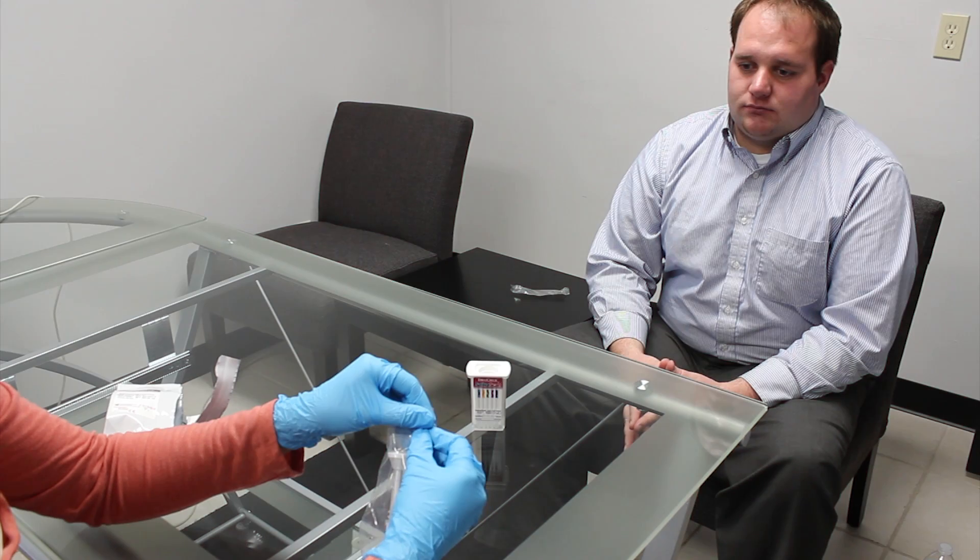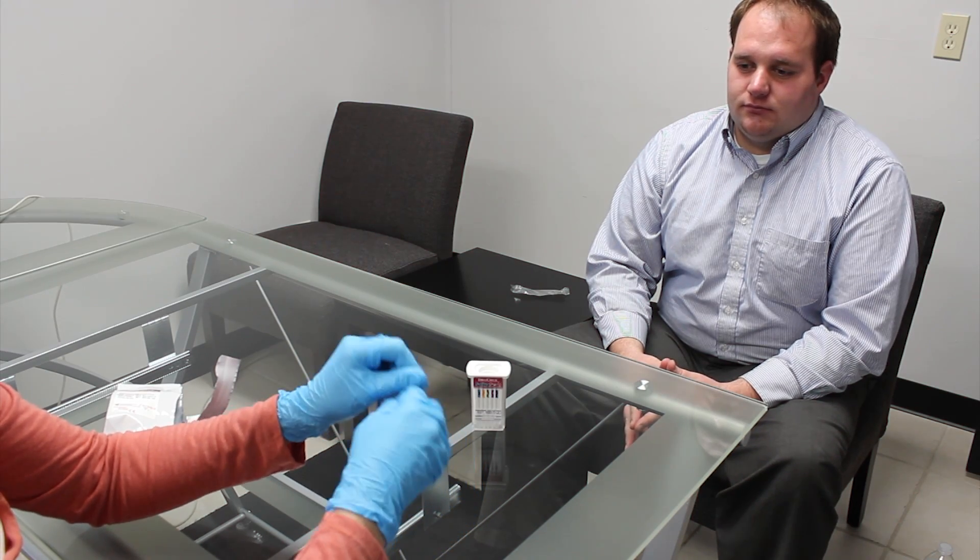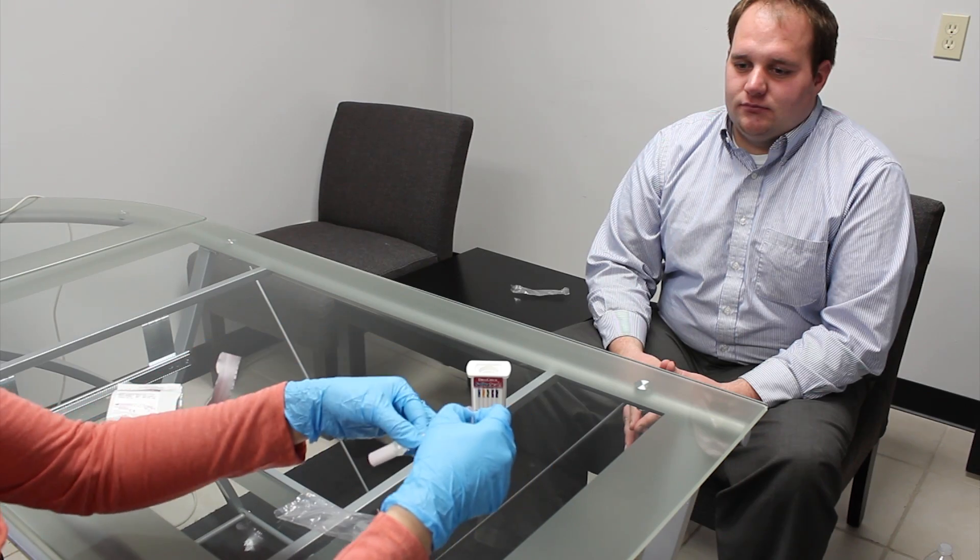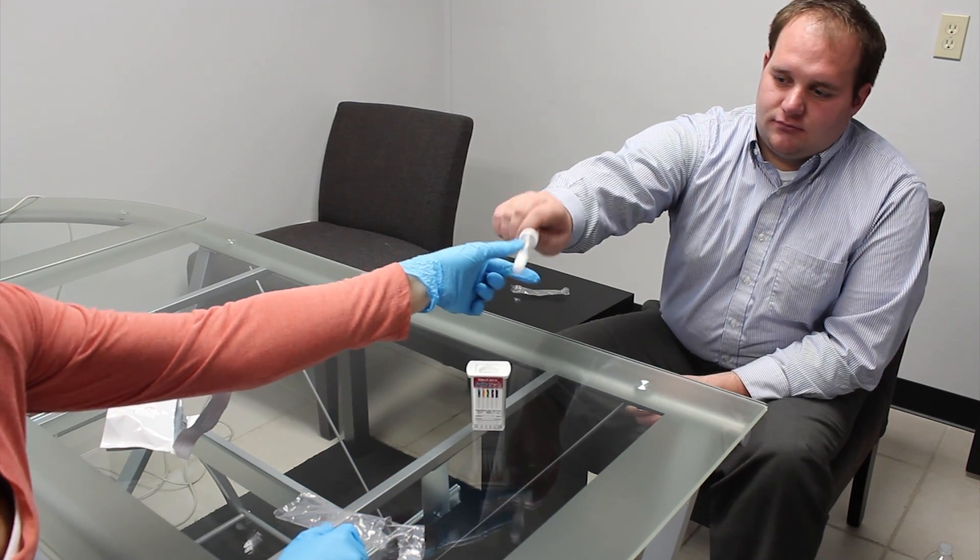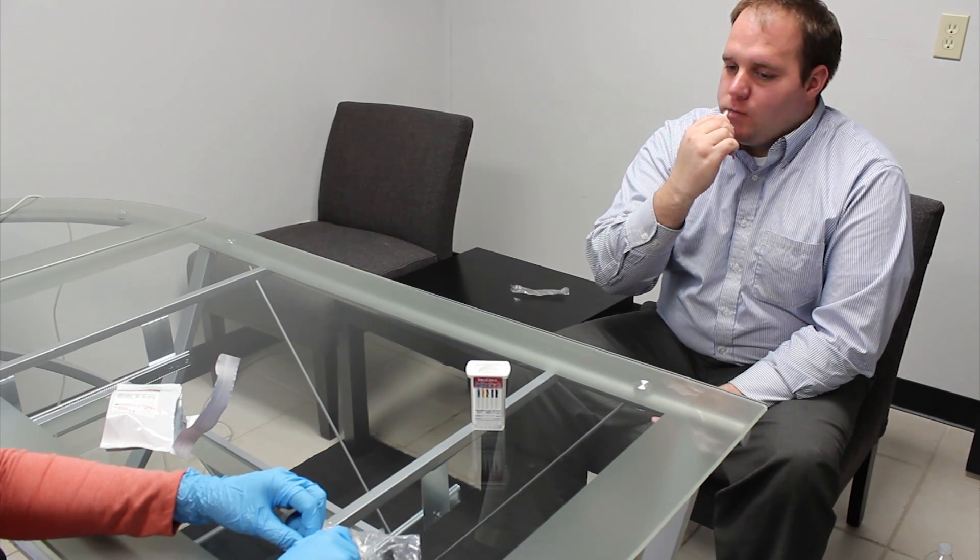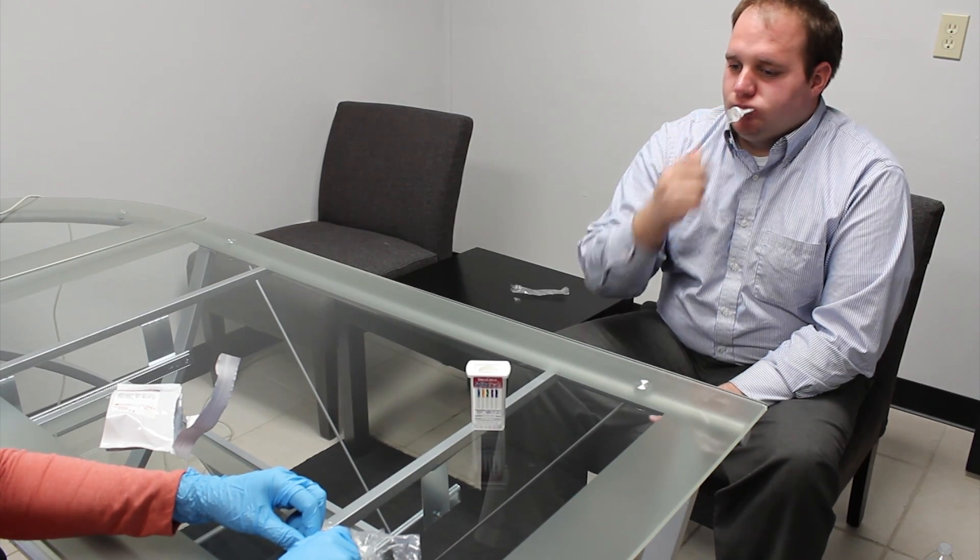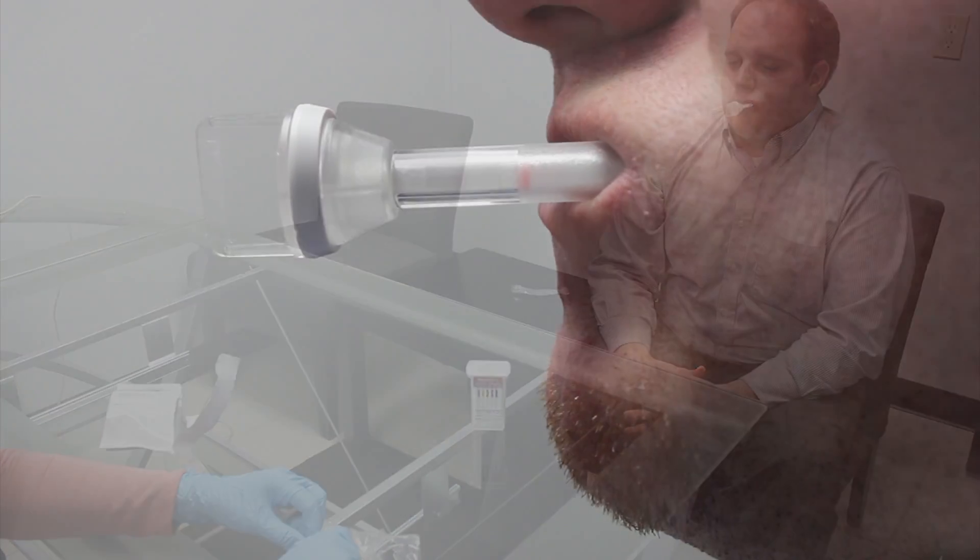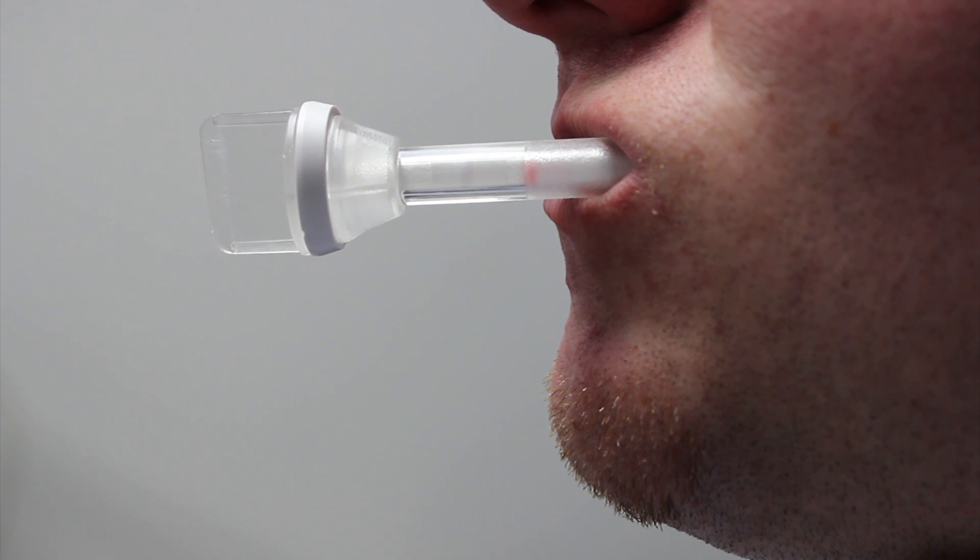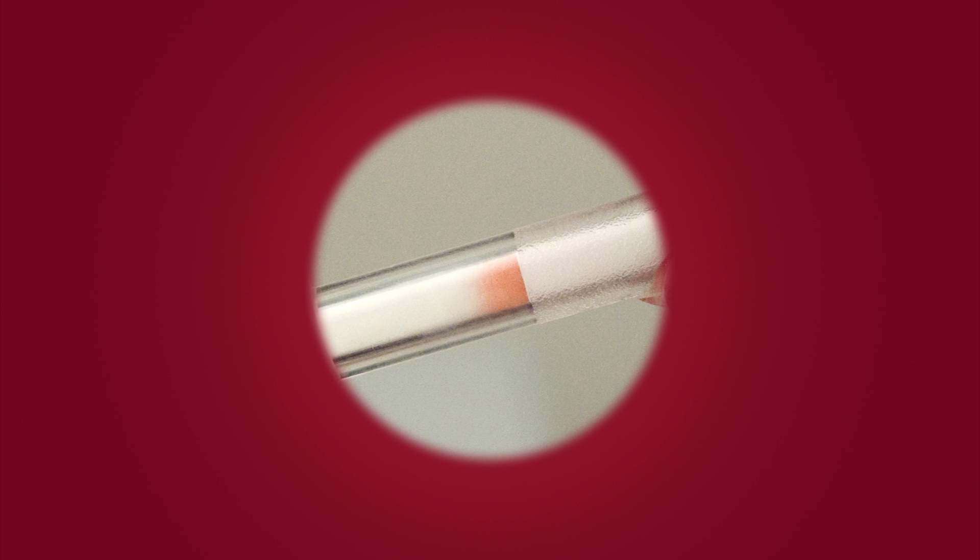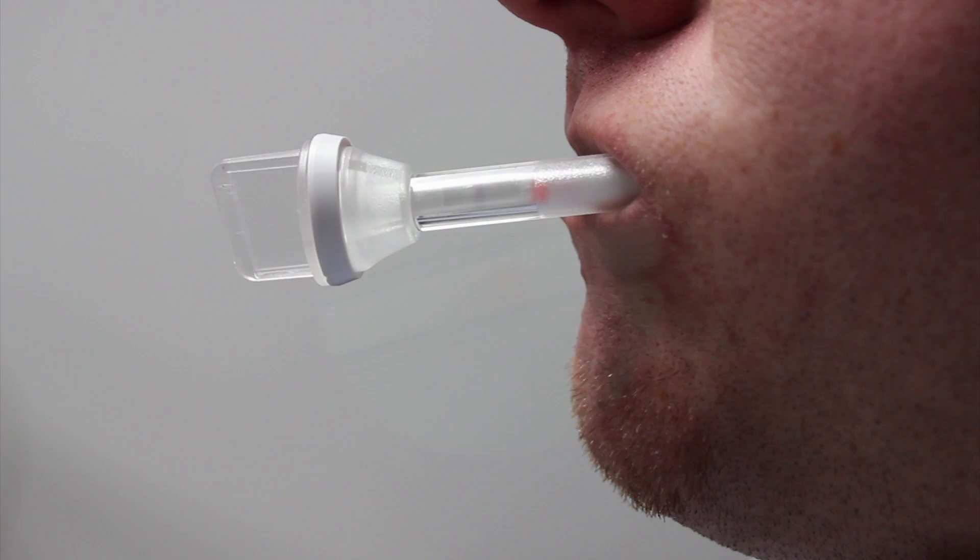Remove the collection swab from the clear pouch without touching the sponge and hand it to the donor. Using the collection swab, have the donor sweep the inside of the mouth, cheek, gums, tongue several times. Then hold the swab in the mouth until red color appears on the saturation indicator strip. The donor must leave the swab in the mouth until instructed to remove it.